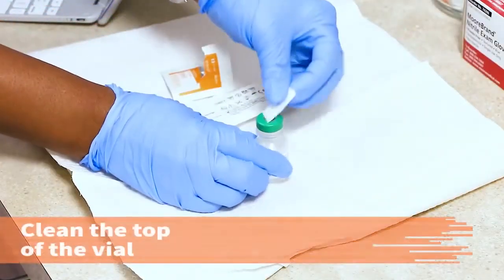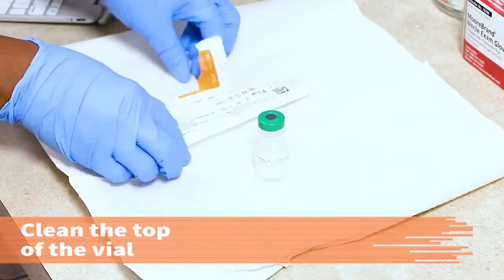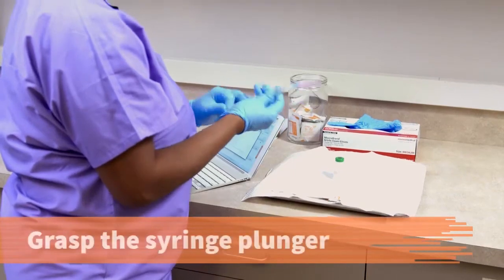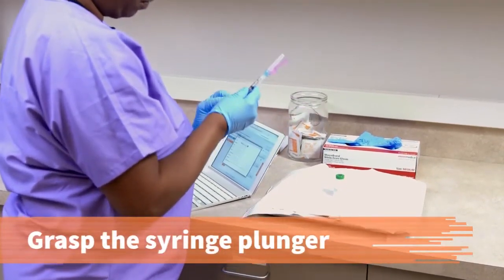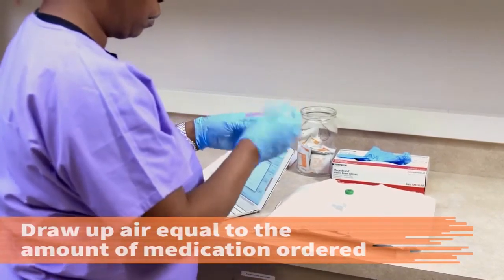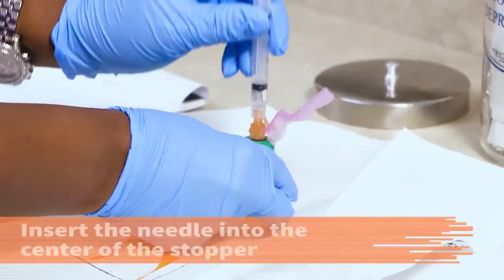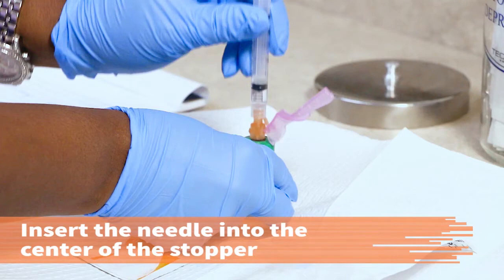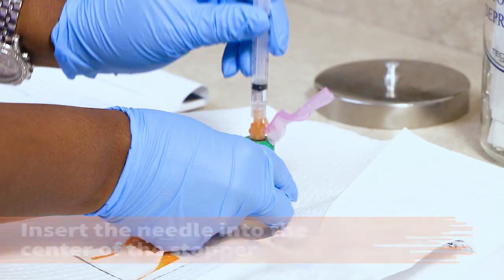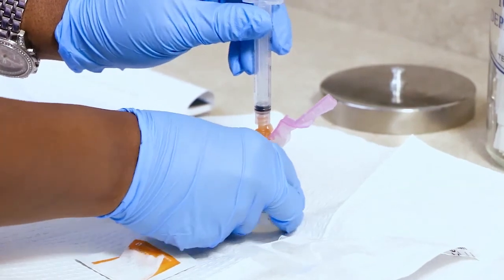Clean the top of the vial with the alcohol wipe using a circular motion. Place the vial on a flat surface. With the needle cover in place, grasp the syringe plunger and draw up an amount of air equal to the amount of medication ordered. Remove the needle cover. Hold the vial firmly against a flat surface and insert the needle into the center of the rubber stopper. Careful that the needle touches only the cleaned rubber area. Inject the aspirated air in the syringe into the vial, making sure the needle is not in the liquid.